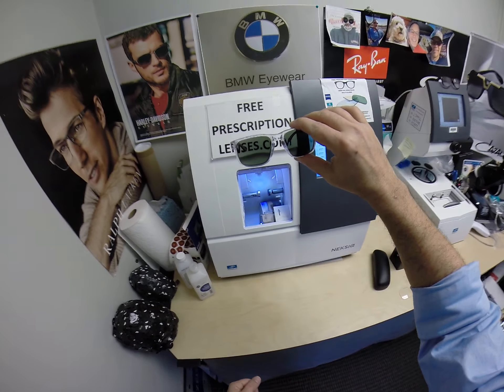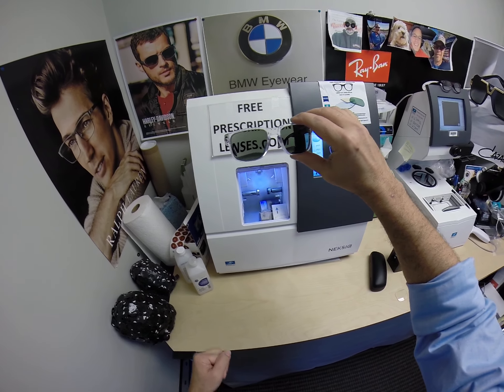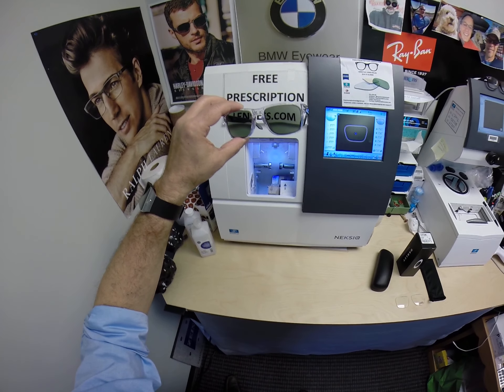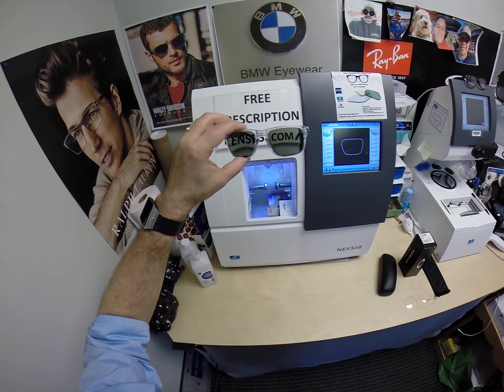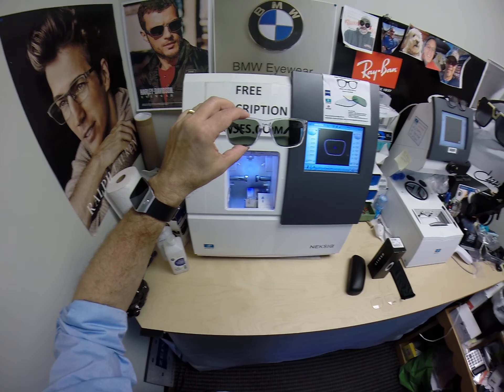Now pay attention — this is important. All Photofusion transition lenses will get dark on day one and continue to darken every day for the first couple of weeks when exposed to the sun. After that, they'll work for years at maximum performance. The only time they won't work is if you're behind the windshield of a car. Your windshield absorbs the sun's harmful ultraviolet rays — that's why your dashboard doesn't crack or your upholstery rot — and that's why the lenses don't turn dark in a car.